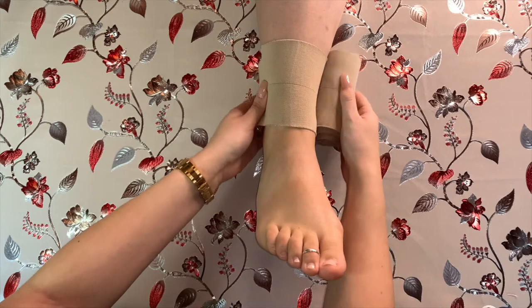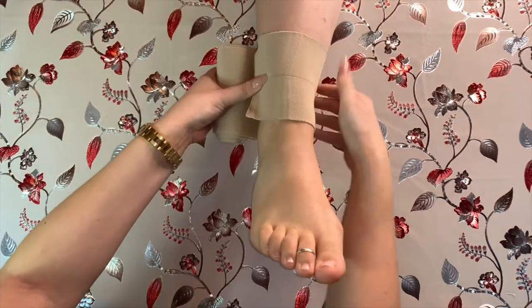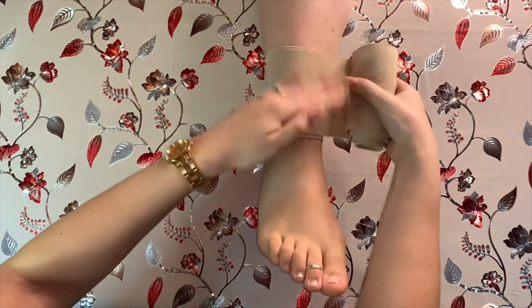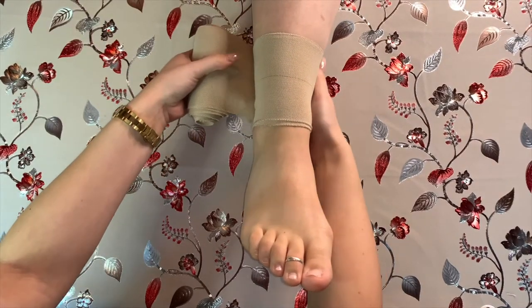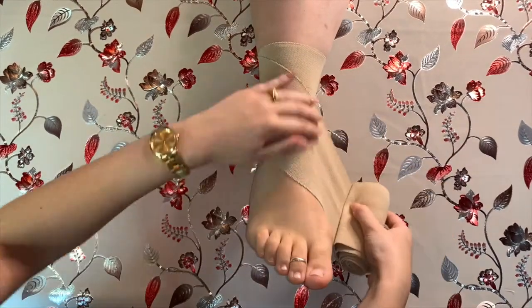Place the bandage on top of the leg just above the ankle bone and below the calf muscle, and we're going to anchor it here. This means wrapping the bandage behind and around the leg two times, pulling it relatively tight and smoothing out the creases as you go, because they can become uncomfortable if compressed for too long — and it gives an even compression.